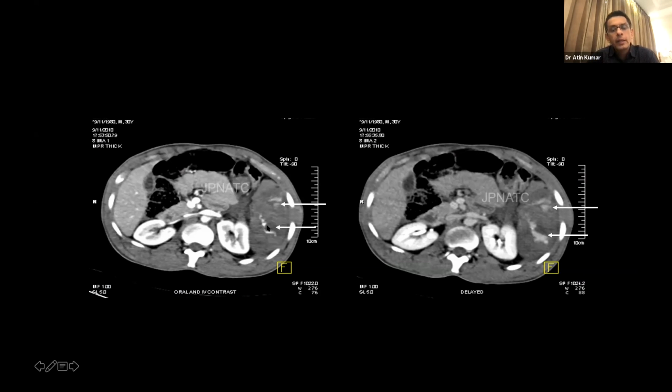How do you confirm it? You do another phase. If you've done the arterial phase, you take the venous phase. If you're doing the venous phase as the first phase, you take immediately another phase just a minute later. If you see the same areas diffusing out, changing in shape, spreading, maybe slightly decreasing in attenuation, then these areas signify that there is active contrast leak, because this is the contrast which has come out of the blood vessel, diffusing out. So this is active contrast extravasation.